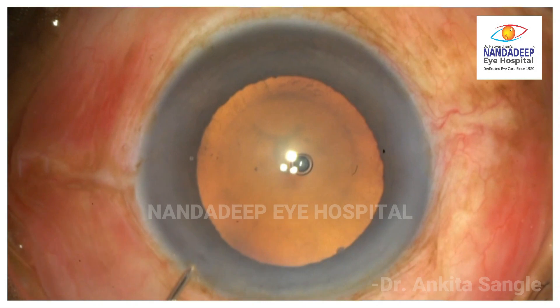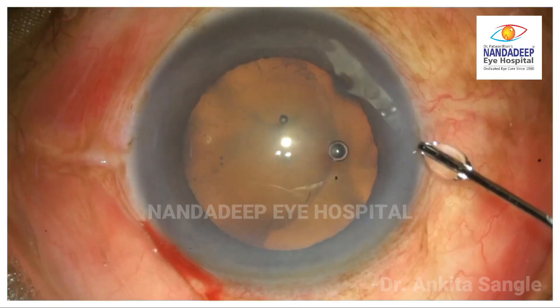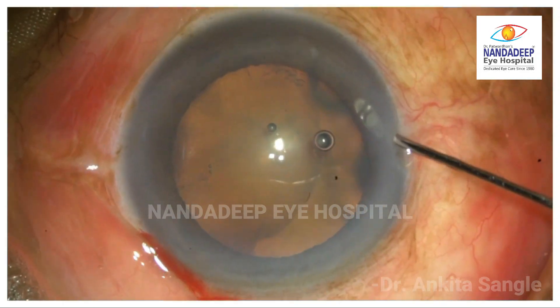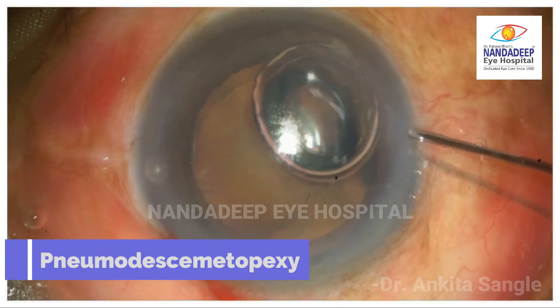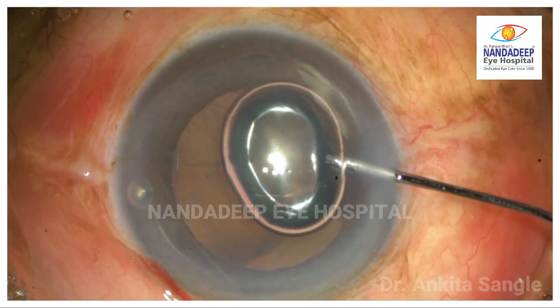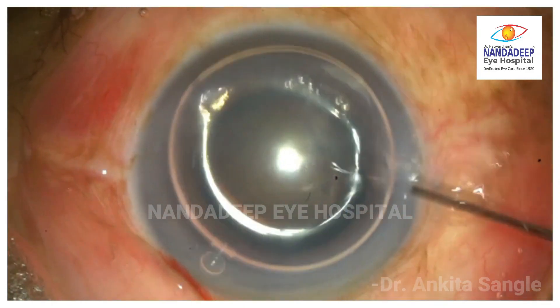What do we do here? Let's watch it again. To manage this, we are injecting a tight air bubble underneath the detached Desmet Membrane — Pneumodesmetopexy. This air bubble helps in attaching the Desmet Membrane back.